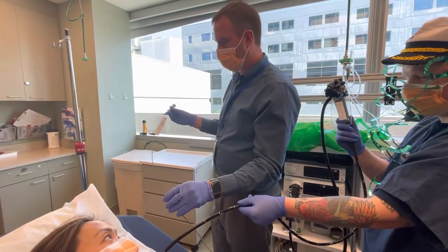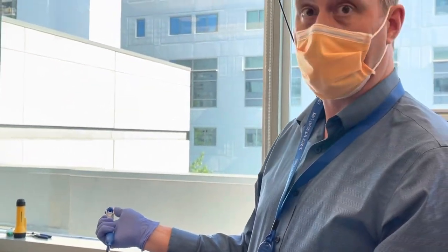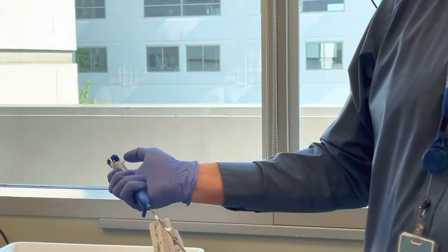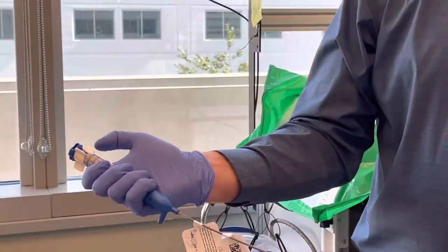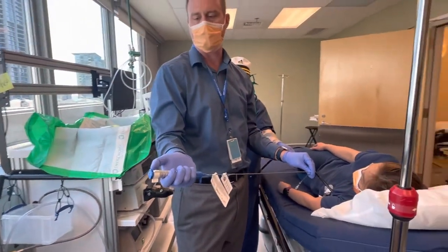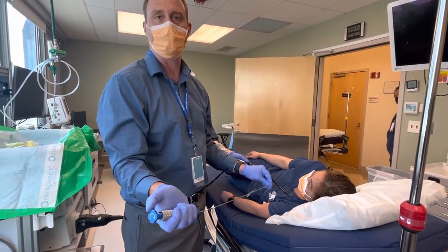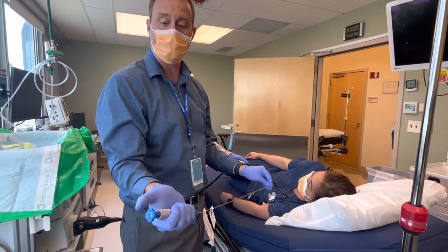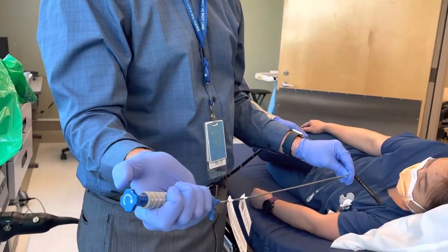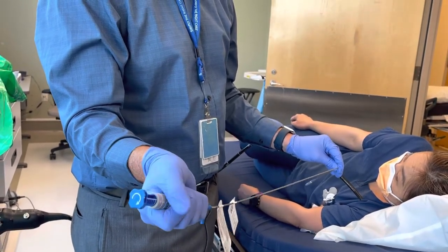Once I have it in the right place, let's say at 35, I'll do this all myself with one hand. This is the safety device — we do suction for 30 seconds, and once they call the time and I see it in 30 seconds, I'll pop this off. Then on the side I'll pull this down with my thumb and flick it — it only needs to go a quarter turn clockwise — so I push down, flick it, and that's it.